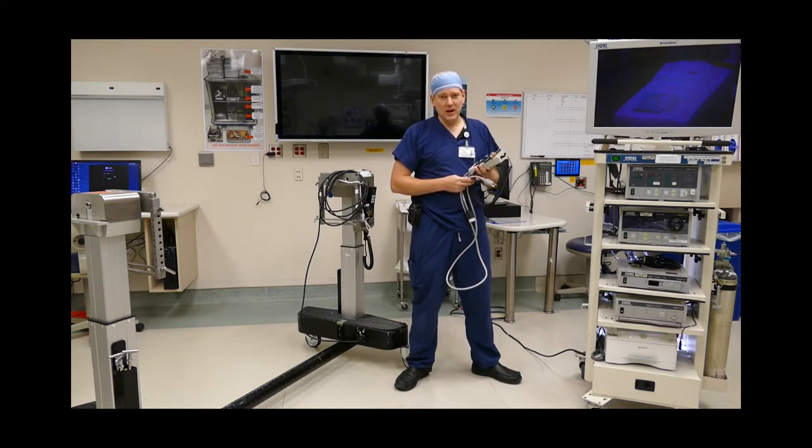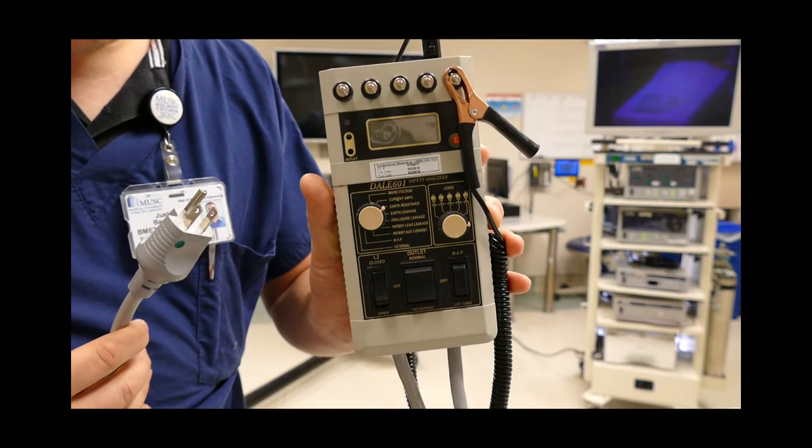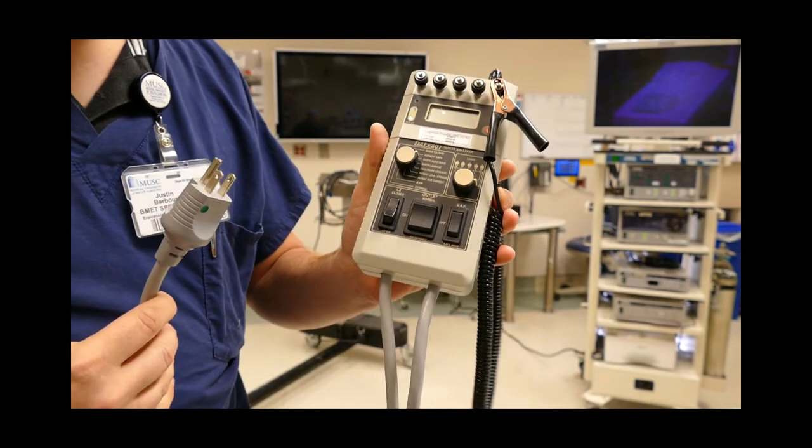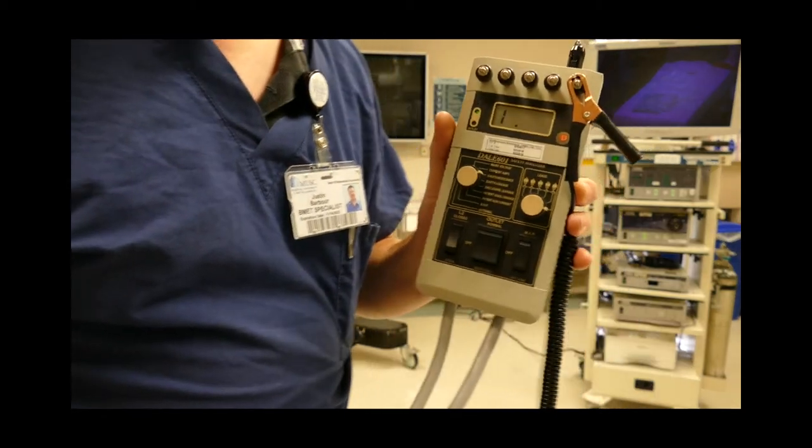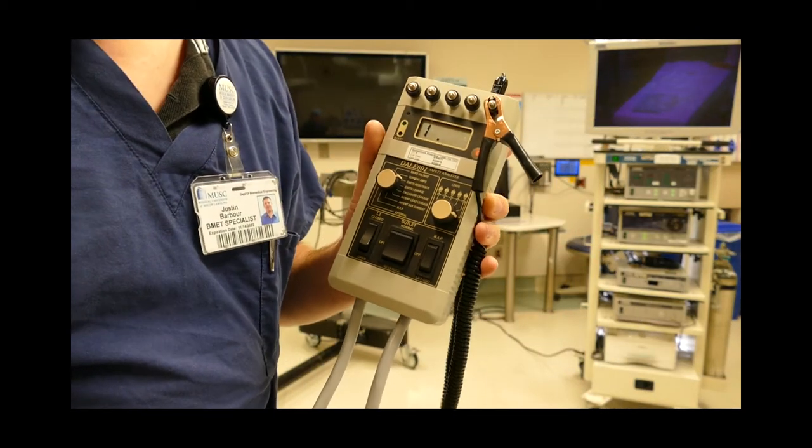Today I'm going to be using a Dale 601 meter. This is a pretty standard electrical safety meter. Just a couple of dials and some flip switches. The first thing to do when testing out electrical safety is you have to check your meter.